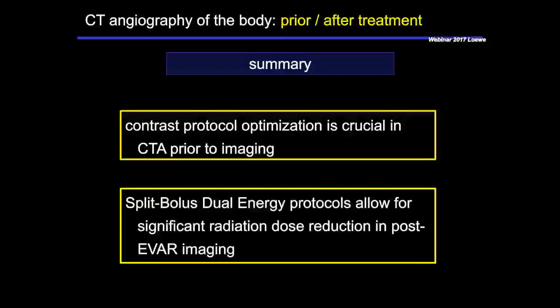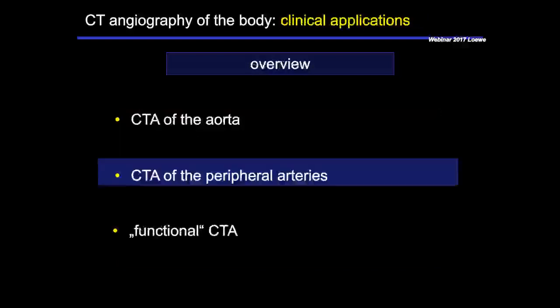So the contrast protocol optimization is, of course, crucial here in this indication prior to and even after endovascular repair. And the split bolus dual energy protocols allow for really significant radiation dose reduction in the post-EVAR imaging. Let's leave the aortic topic and move on to the CTA of the peripheral arteries.